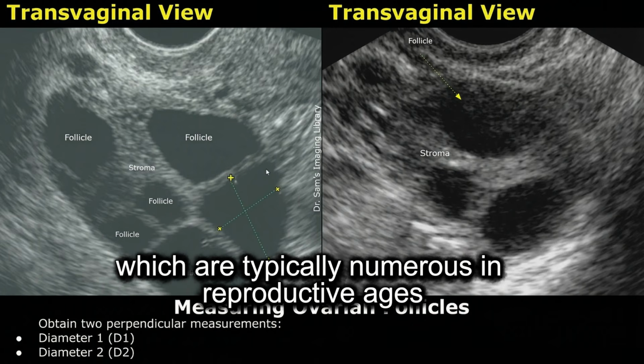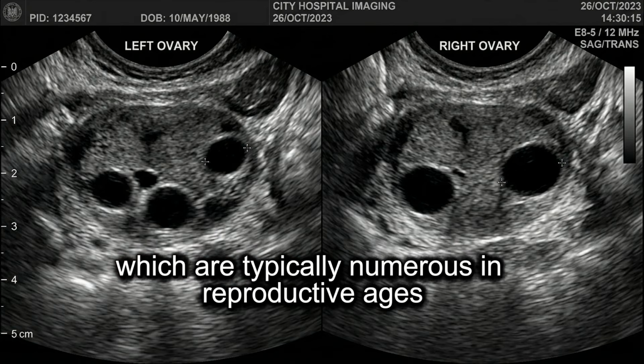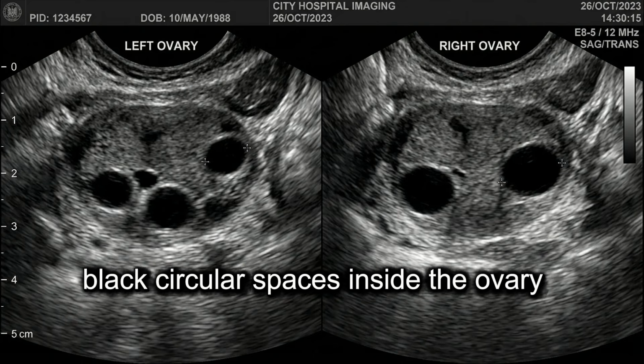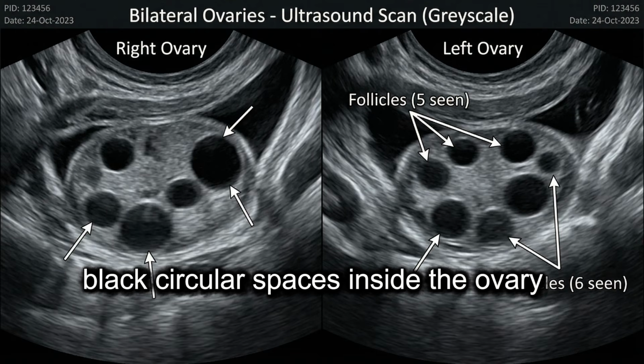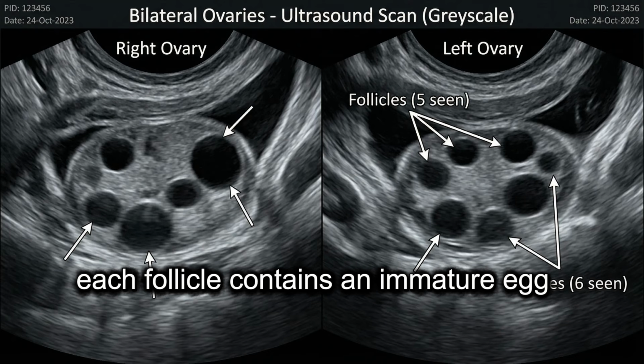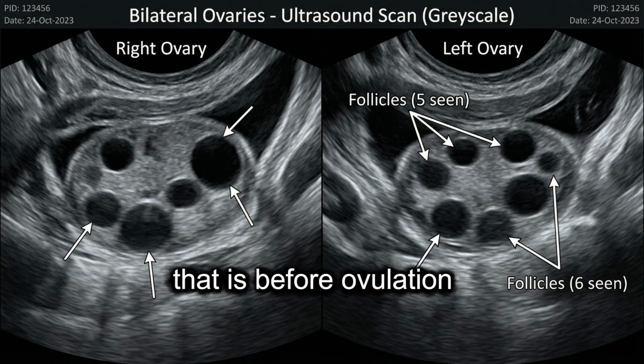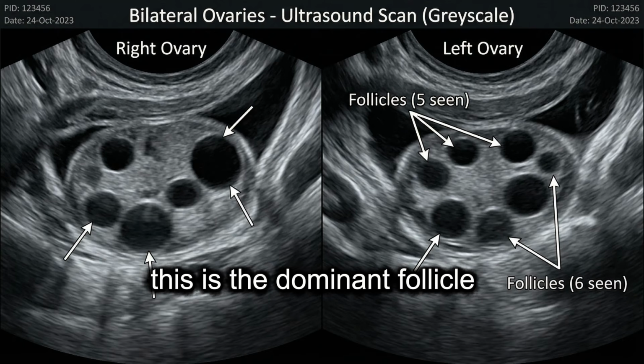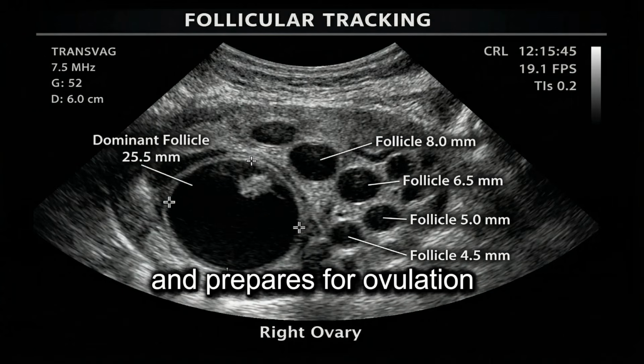One of the most important features? Follicles, which are typically numerous in reproductive ages. These look like small, dark, black circular spaces inside the ovary. Each follicle contains an immature egg. Before ovulation, one follicle grows larger. This is the dominant follicle and prepares for ovulation.